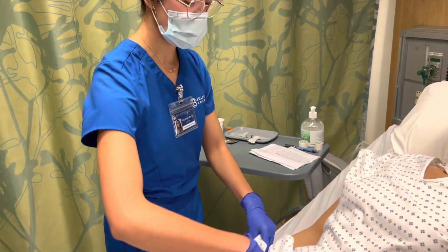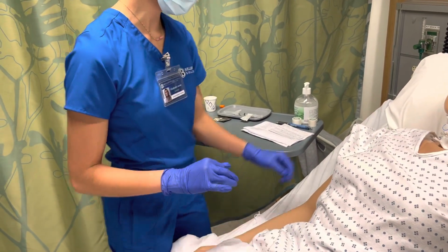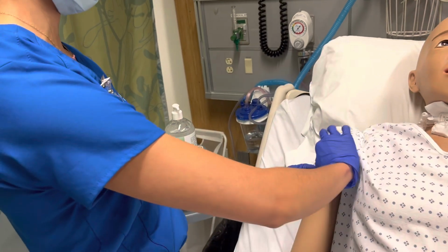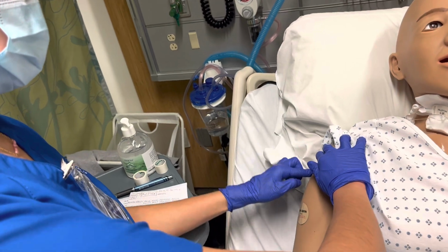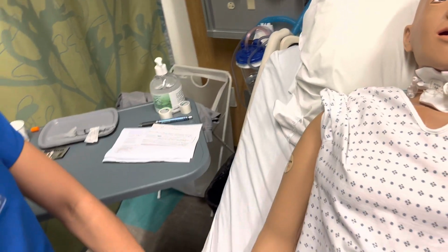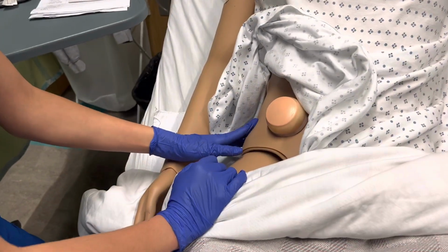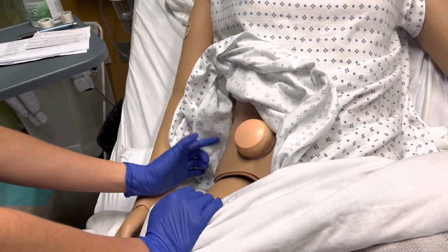Okay, next we're going to do our IM injection for your Ketorolac. So there are 3 different sites I could do an IM injection. The first would be the deltoid here. So I would find the acromion process and 2 fingers and go there central to the deltoid muscle. The next site that I could administer an IM injection would be here at the ventrogluteal site.